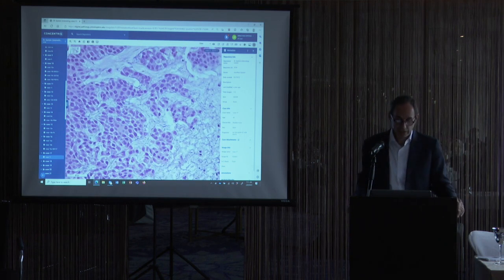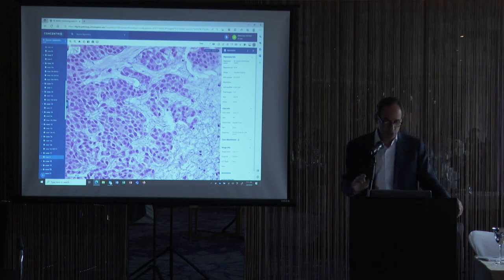So what do you do in that case? There are different schools of thought. Some urological pathology experts, for example, when they see a case like this, will call it invasive high-grade cancer, even though morphologically it's low-grade. And the rationale for that is, biologically, it is high-grade, even though it's not that high grade cytologically, we're not seeing a lot of mitoses, etc. Once it invades, whether it looks low grade or looks high grade, it all has the same prognosis. So some experts would call this invasive high grade.